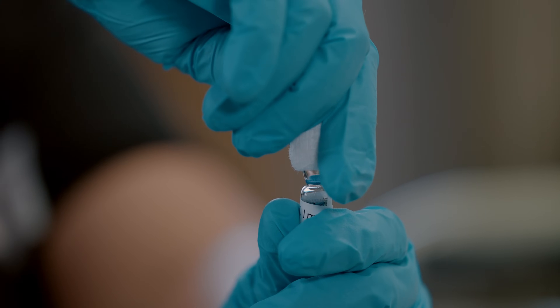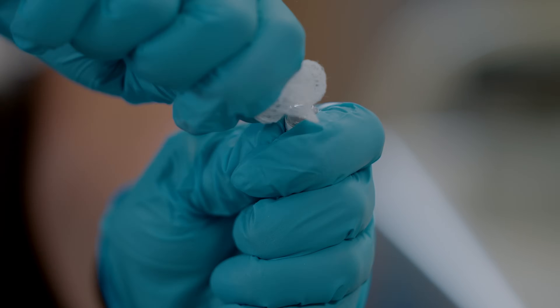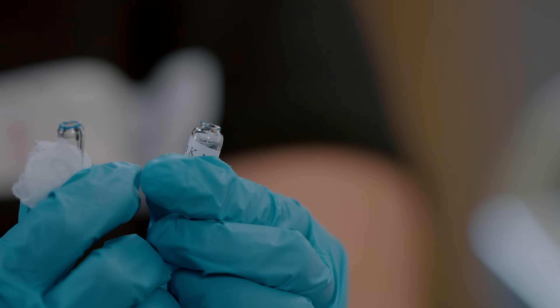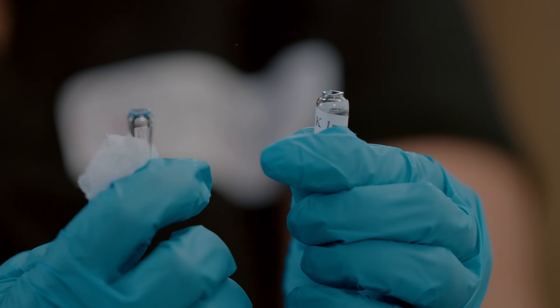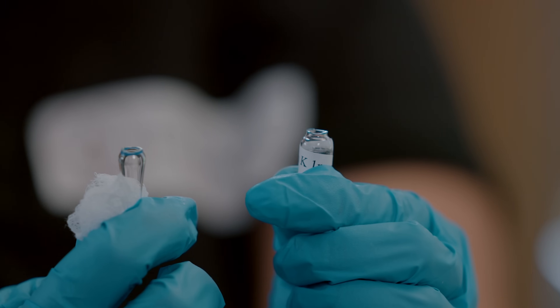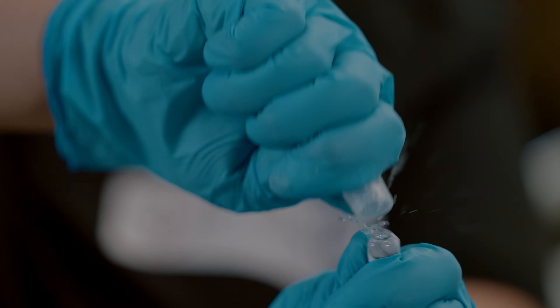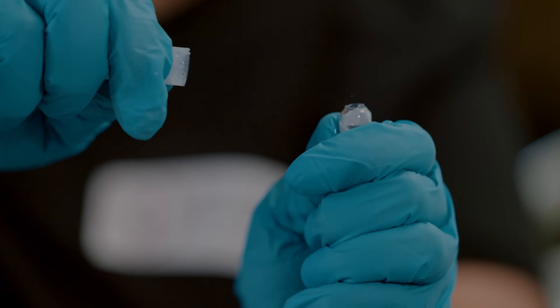Put your dominant thumb over the dot and line up your non-dominant thumb with it on the base. Then, using your thumbs, break the ampoule away from your body — this is where a lot of people make mistakes and cut themselves. Some hospitals also use disposable plastic glass ampoule breakers, so if that's available, you can use that for this step.